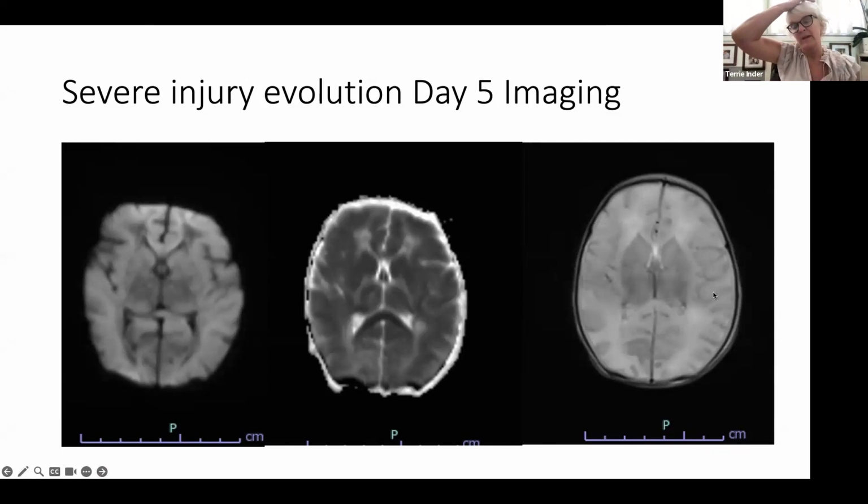And the other thing that can be prominent, particularly in the early severe cases, is you'll start to see the blood vessels popping out because they are standing out as having sort of normal characteristics. And usually you don't see them. But when you've had this severe diffuse brain injury, then that can persist.